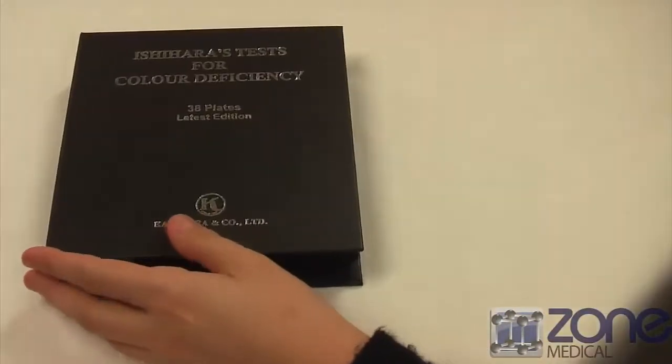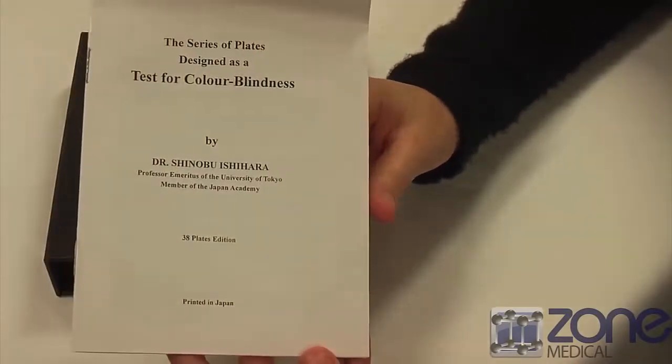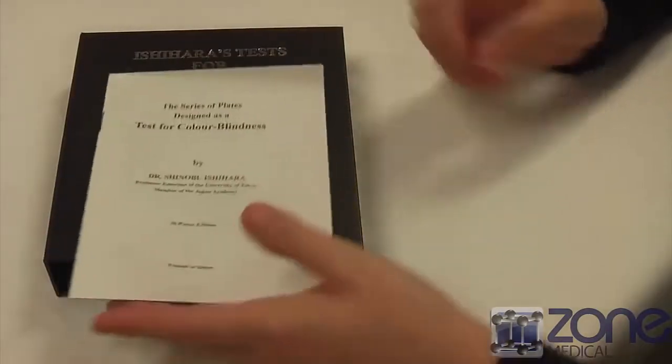From here you would just go through this little manual and have a look at all the results from your patient, and that is Ishihara's test for color blindness.